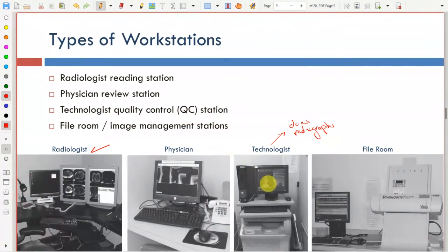So before he operates the system, he has to do some quality control checks. He has to put a phantom inside the machine and take an image of that phantom and take some measurements, things of that sort, so that he can do a regular daily check on the system before he uses it on patients, just in case there is something wrong or the images come up with something that doesn't look right. He can actually detect that before he starts applying the system to patients.